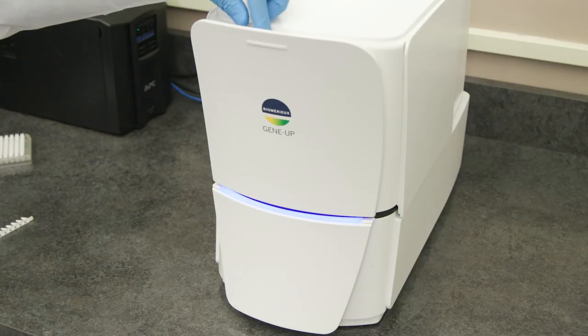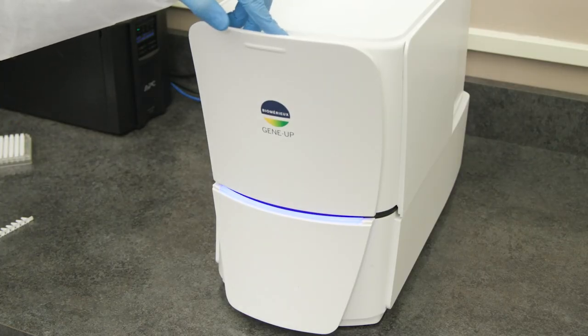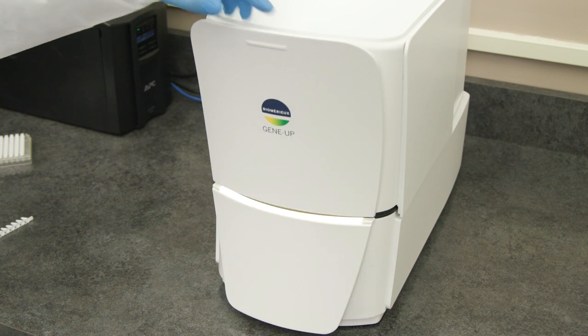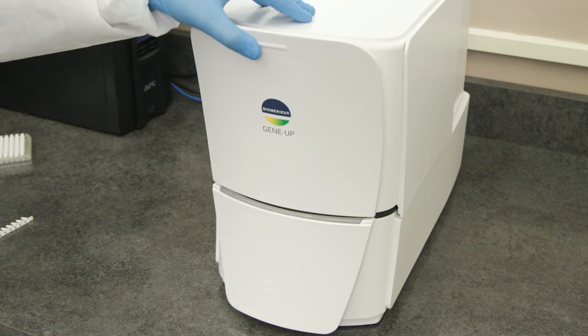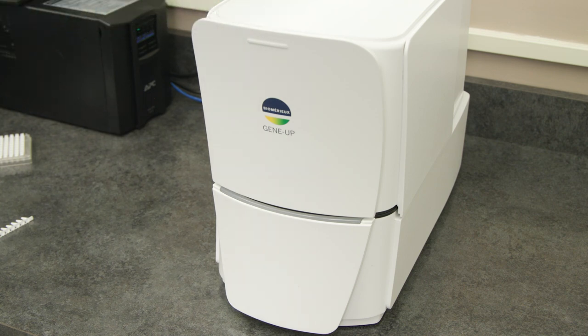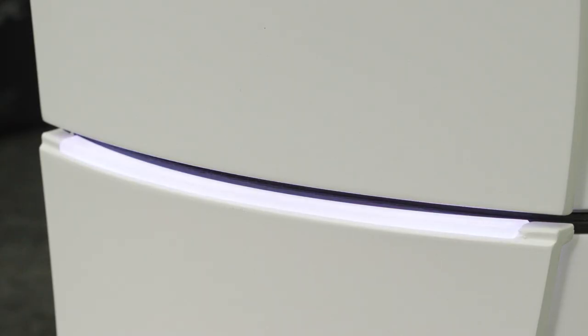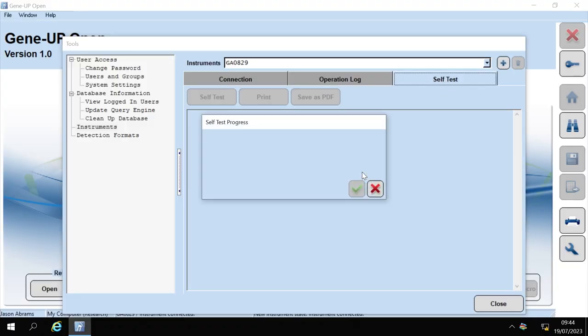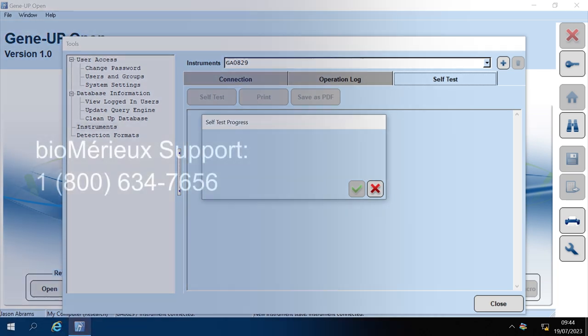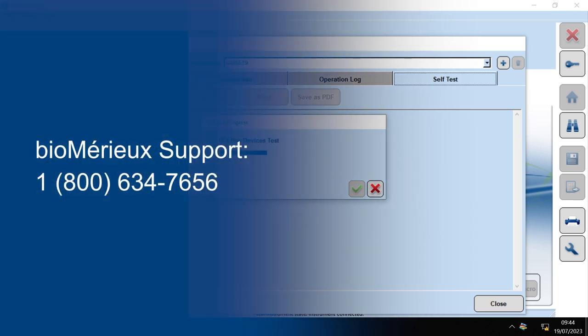If this should happen, power cycle off and on the GeneUp by pulling on the faceplate until the status light turns off. Then push on the faceplate to turn on. Wait until the status light turns to a solid blue. Rerun the self-test following the previous steps. If the self-test fails a second time, please call your BioMérieux support. Please make sure you have your functional location or customer number ready.